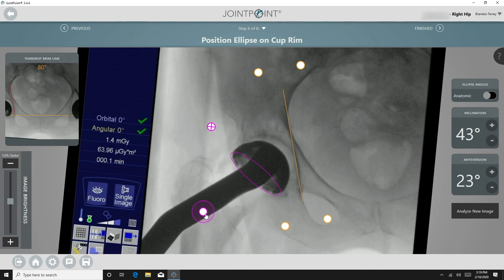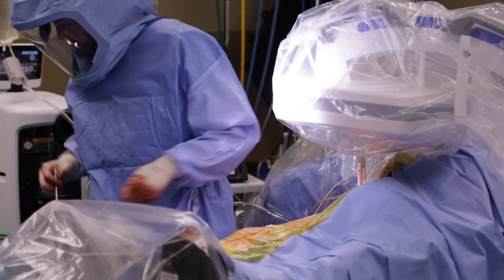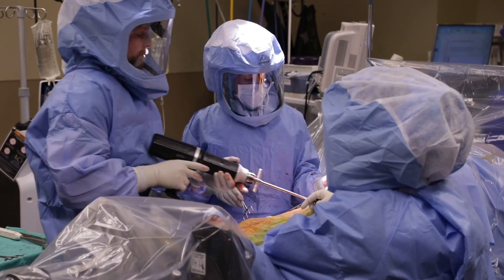The cup is inserted with the desired anteversion and inclination angles. The cup is impacted into its final position and the impactor handle is removed. The final position is analyzed, and the final liner is then impacted using the Concise impactor.